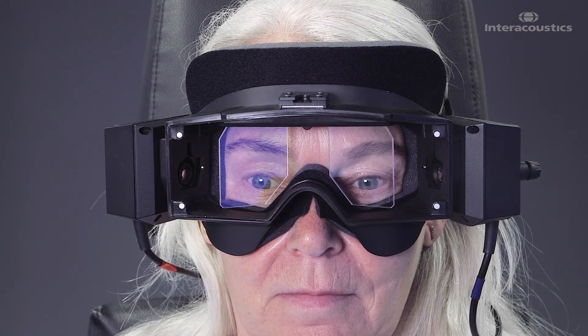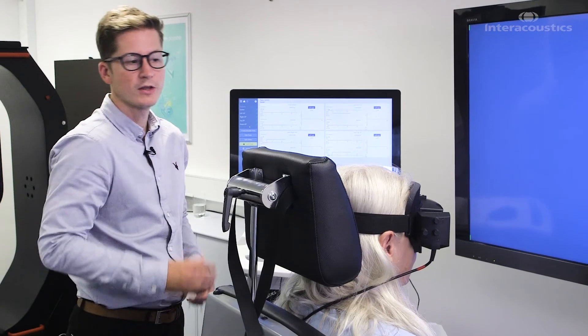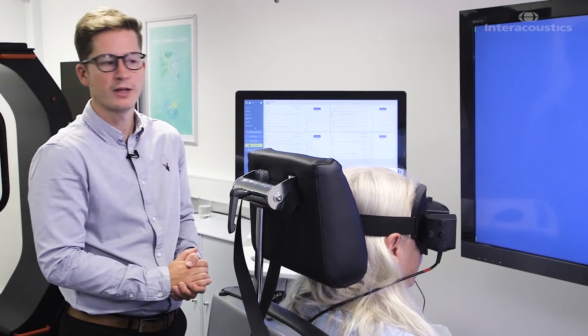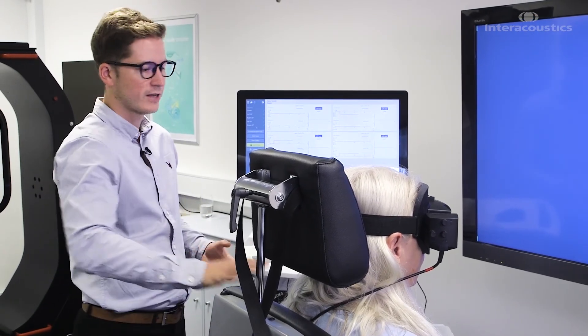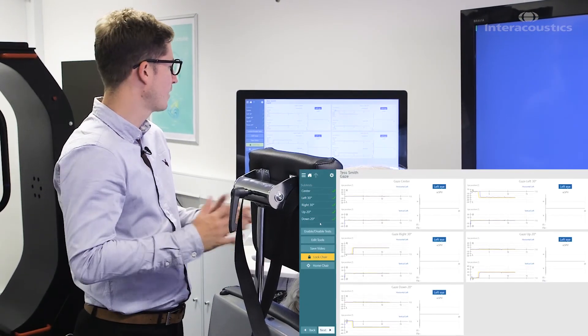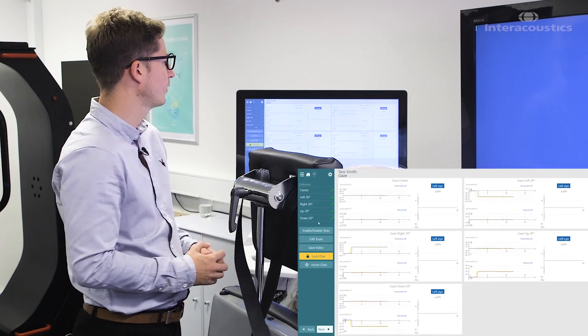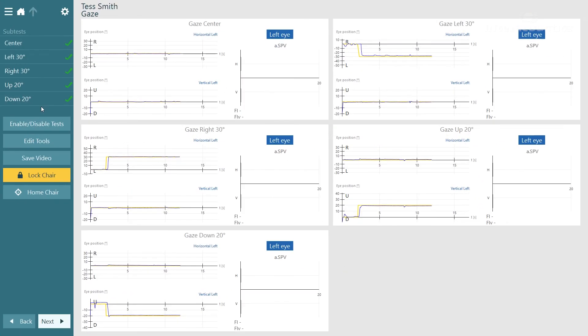Zero. Excellent. So now that the test is finished I can say to you Tess you can relax close your eyes whilst I have a quick look at the results screen.